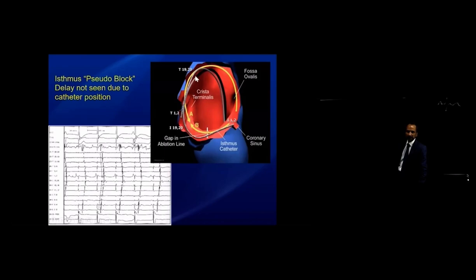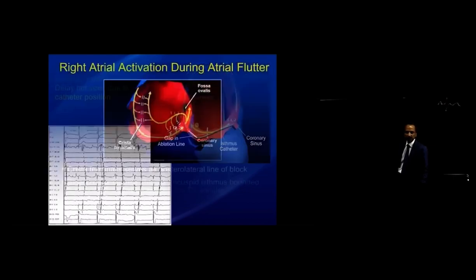If we have electrodes further away or they're not closely spaced, then we get fused wave fronts even before we ablate. And once we start ablating and there's delay on one wavefront, it will look like we have block when we actually just have a different degree of fusion as a result of slow conduction from our ablation line.